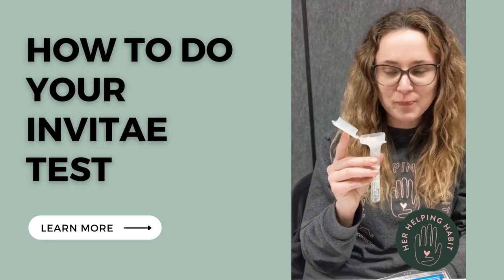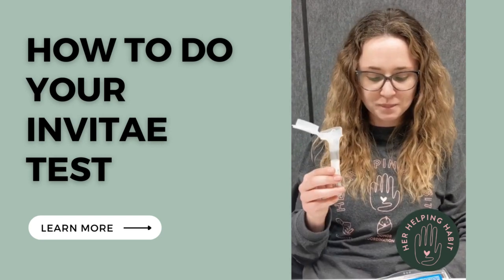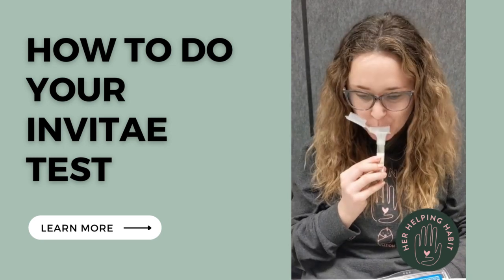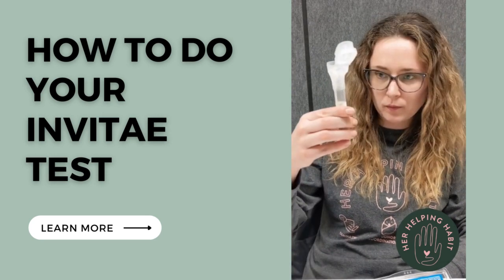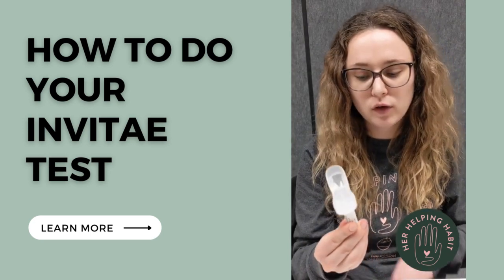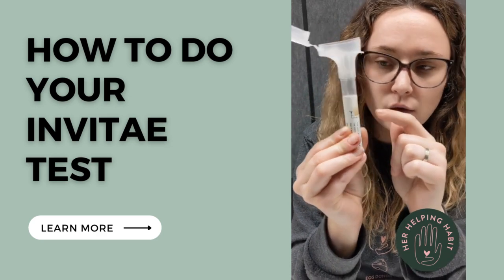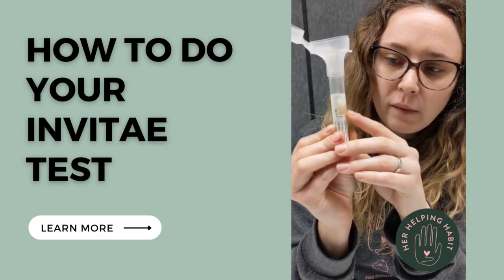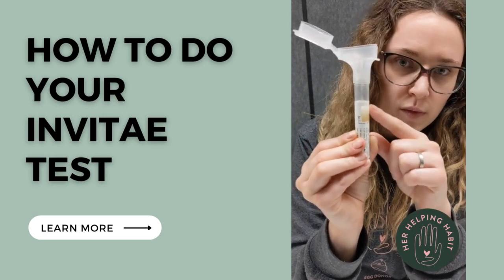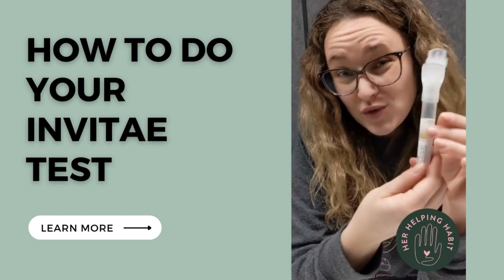Here are some tips: close your mouth and wiggle your tongue left to right. You can also make chewing motions with your mouth, gently rub the outside of your cheeks just behind your back teeth, smell or imagine smelling sour foods such as a lemon, or think about your favorite food. Once you're done, make sure your saliva goes right up to the line and that your bubbles are above the line — not just at the line. Make sure we really have enough saliva, otherwise you might have to do another kit.